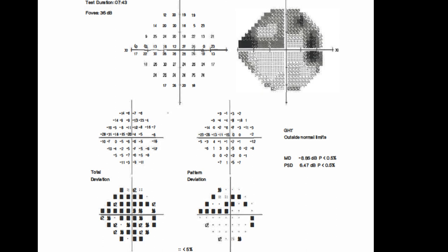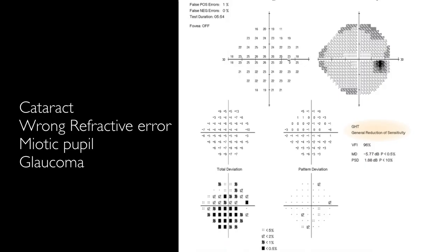Generally, the pattern deviation looks less darker than total deviation plot in glaucoma patients.